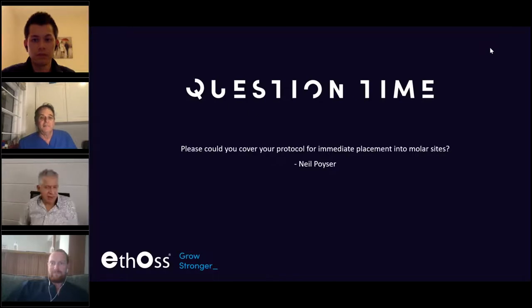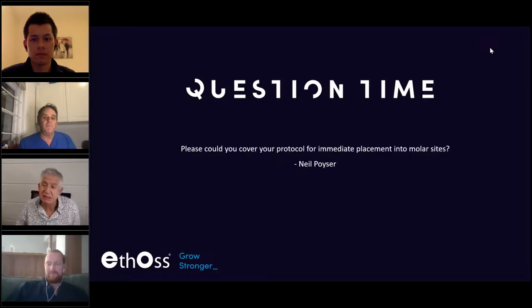No, I don't necessarily think it's a bad thing. It may very well be a good thing in selected cases. I think there is a place for it, but generally I don't do coronectomies. Do I graft molar sites? I'll be honest and I'll say no, I don't. But it makes sense that maybe you get less distal pocketing if you do graft them.